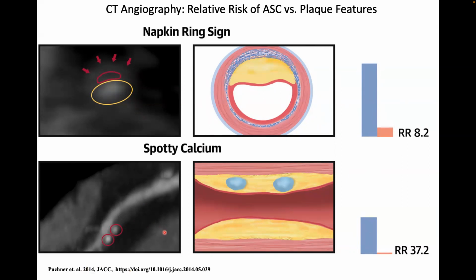So this data will just get better as these pictures get better, right? As coronary CTAs become more common and there is more data available, and as the machines themselves, as photon counting machines come online, these pictures are going to get better. But that's a decade away from having a lot of photon counting machines available.